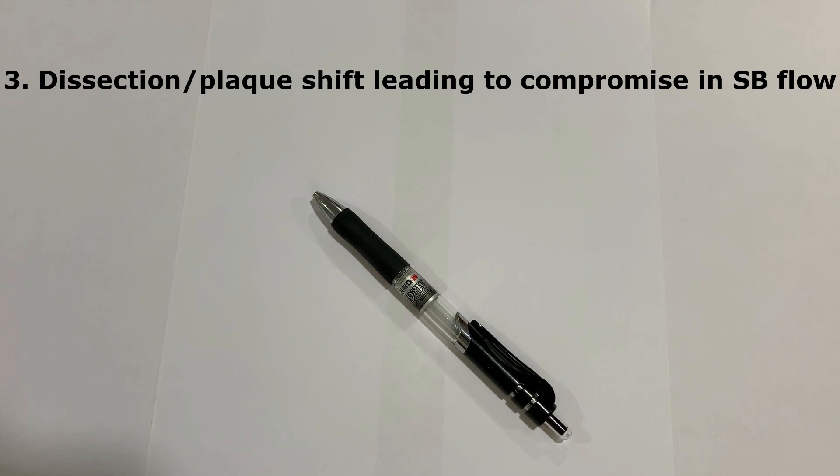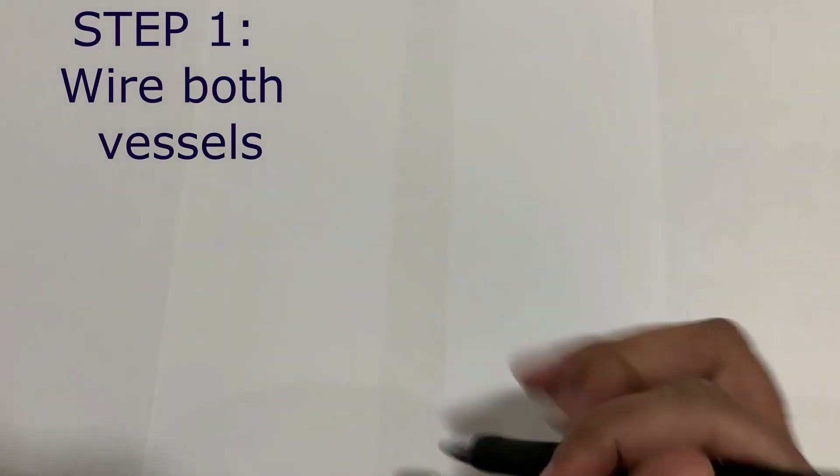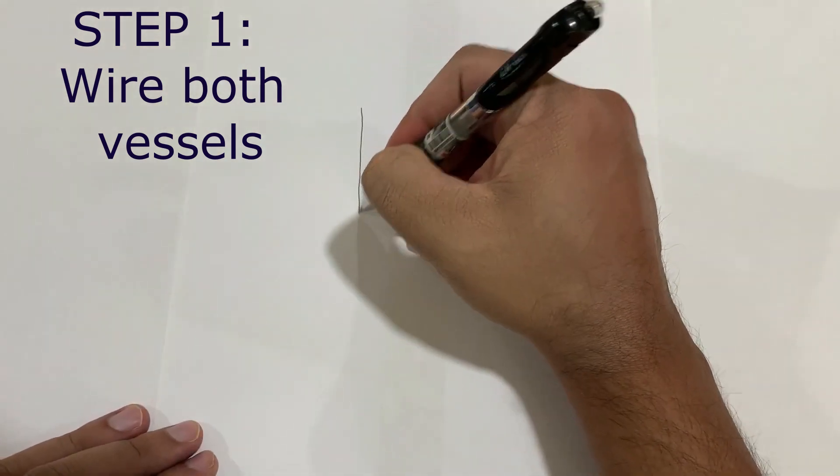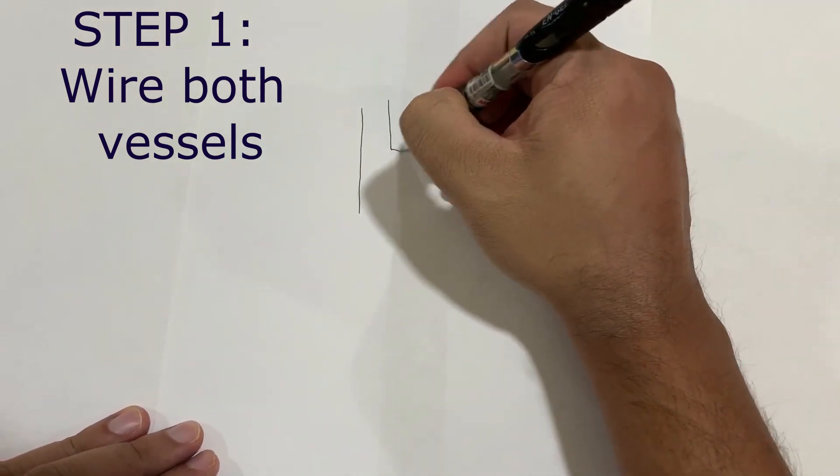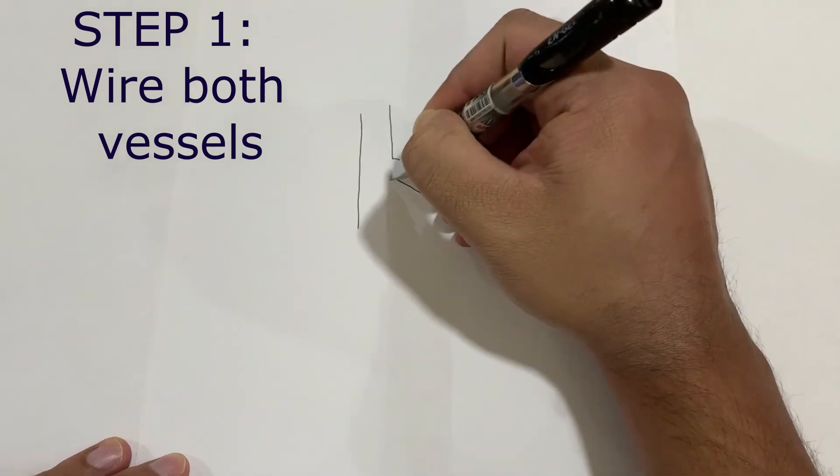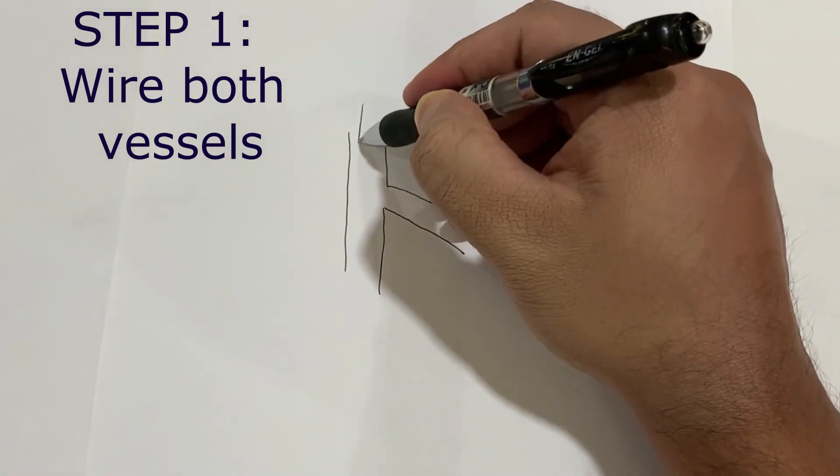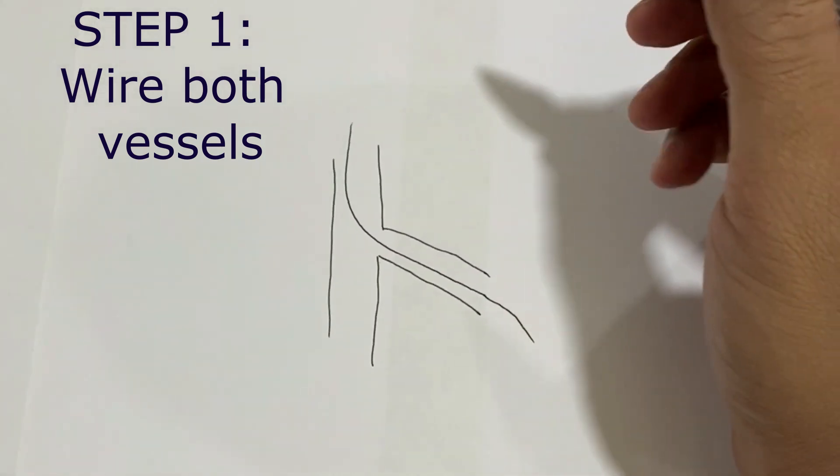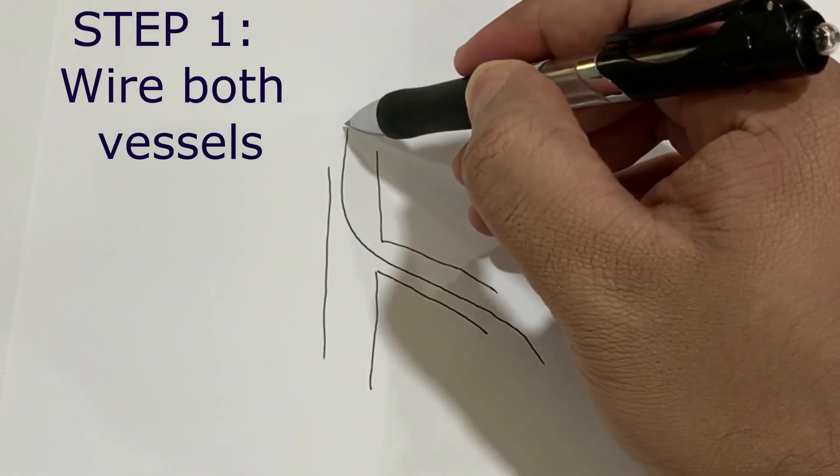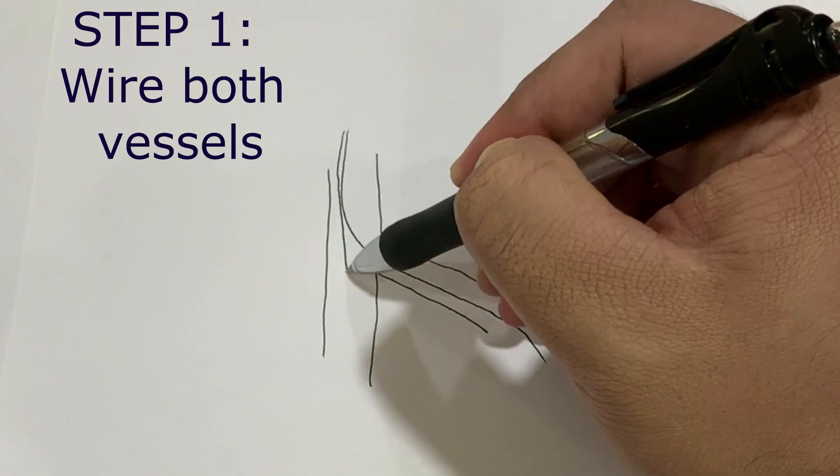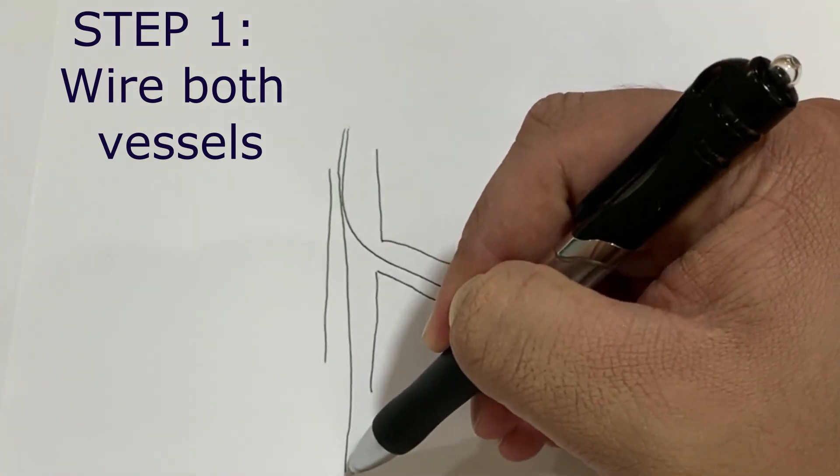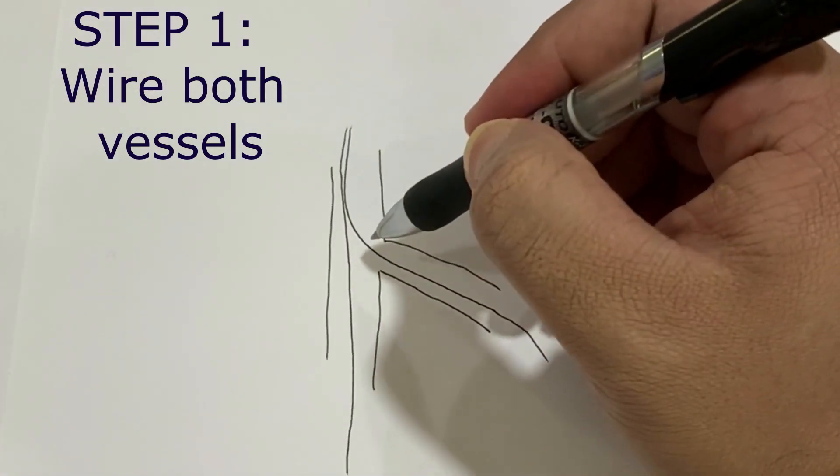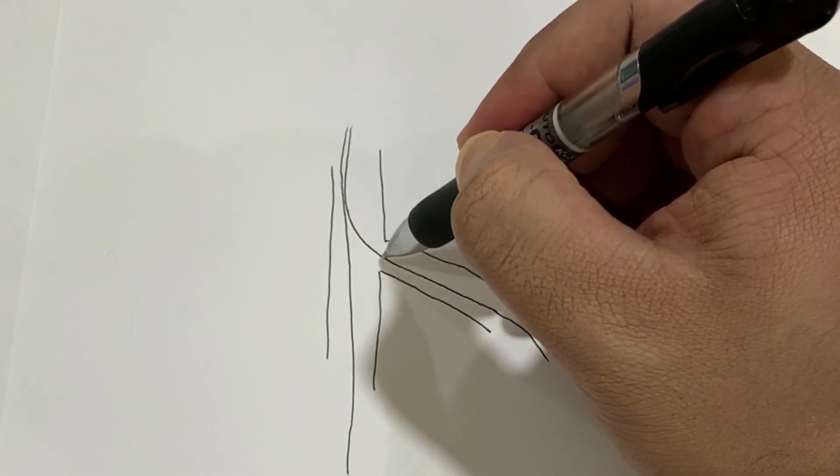So here are the few steps. First, wire the lesion which is more difficult to wire, so usually a side branch lesion is more difficult to wire. Once you wire this, put another wire in the main branch.